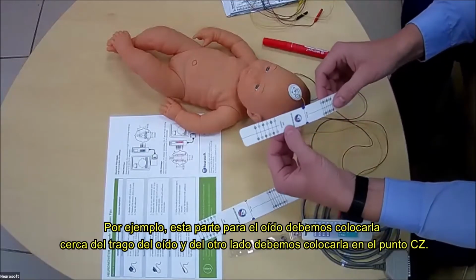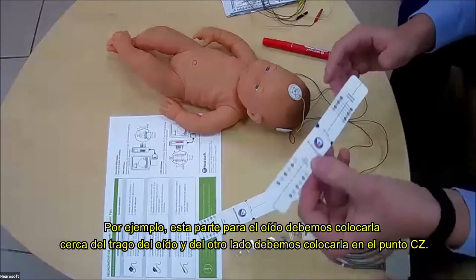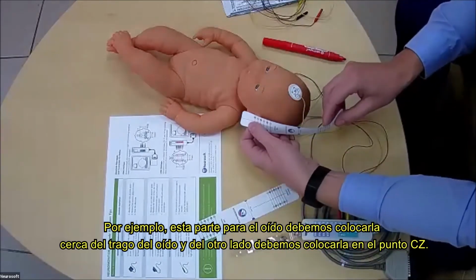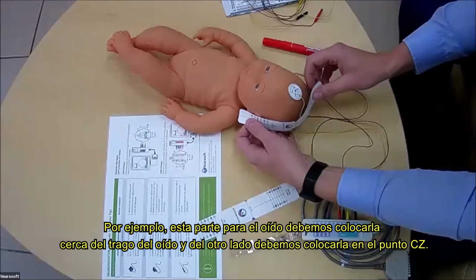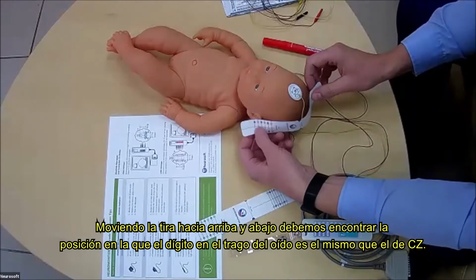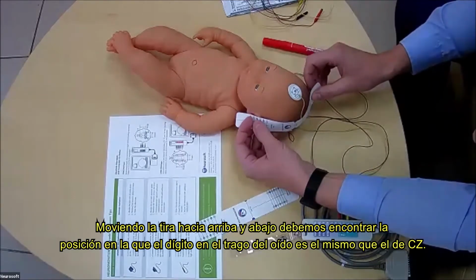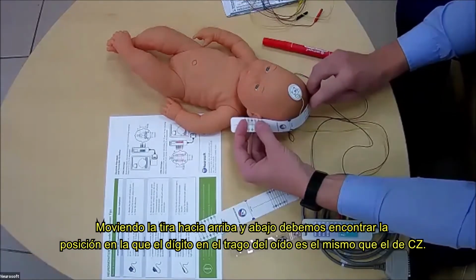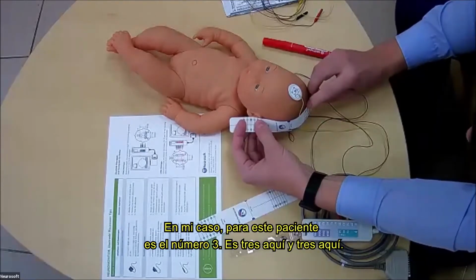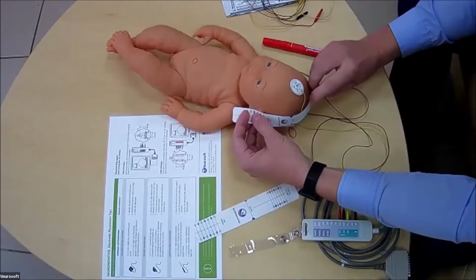For example, with this ear tragus part, we need to put it near the ear tragus. And from the other side, we need to put it on the CZ point. Moving this strip up and down, we need to find the position where the digit on the ear tragus is the same as the digit on the CZ. For this patient, it is number 3. It is 3 here and 3 here.